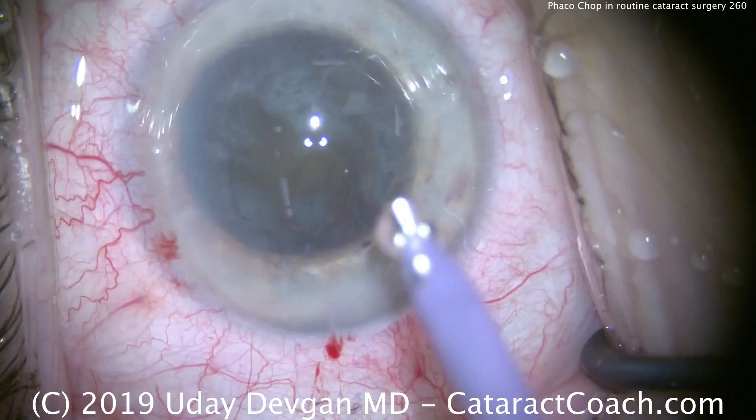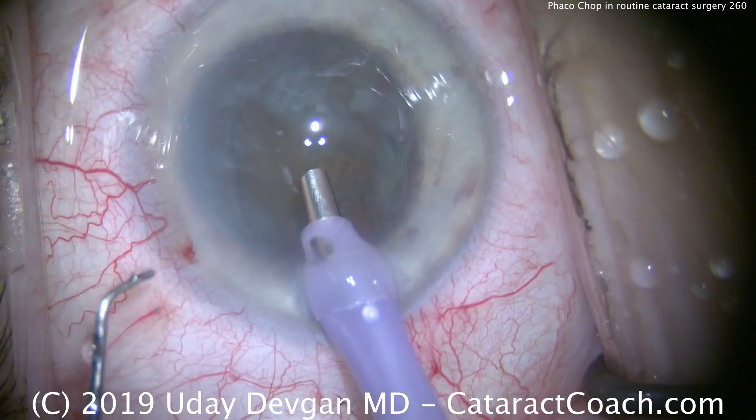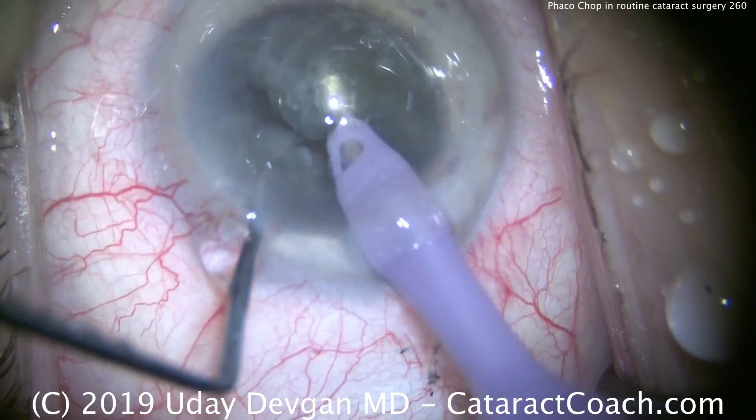Here's the phacoprobe. I'm going to put this inside the eye. Phacoprobe coming in on chop mode — high flow, high vacuum. I'm going to buzz into the nucleus, place the chopper, and there's our first chop. We have two halves.